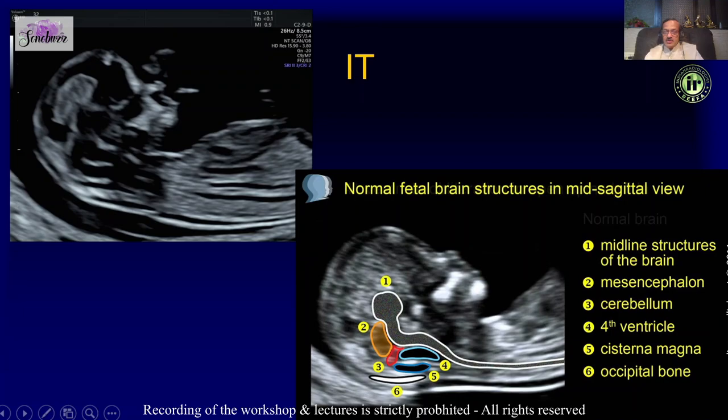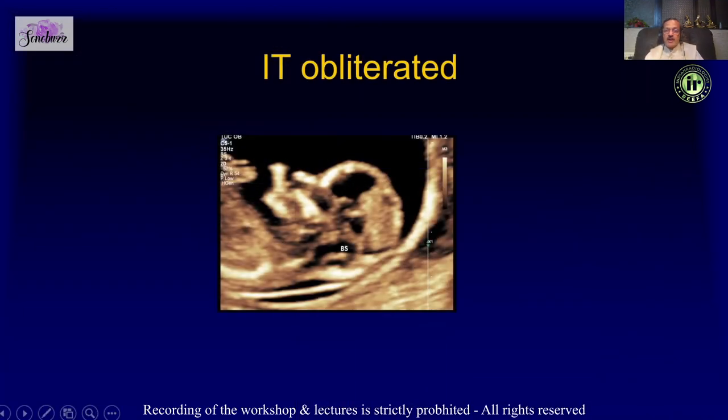Here is an example where the intracranial translucency is obliterated and the brainstem looks very prominent — that is a sign of neural tube defect. We can also take what is known as the brainstem to brainstem-occipital distance.